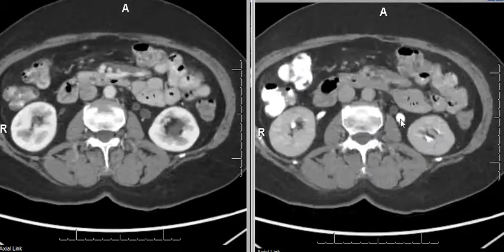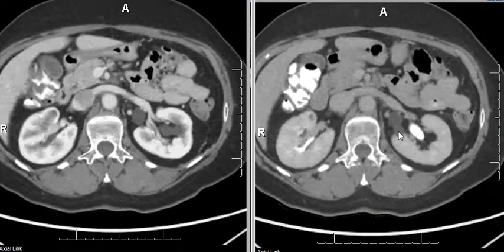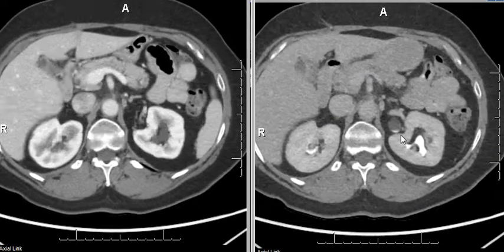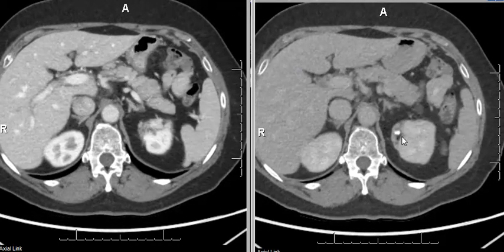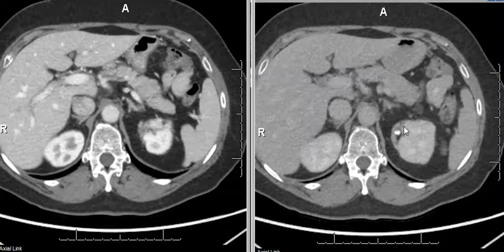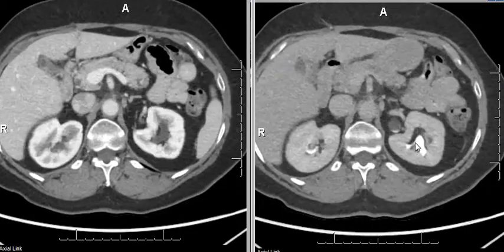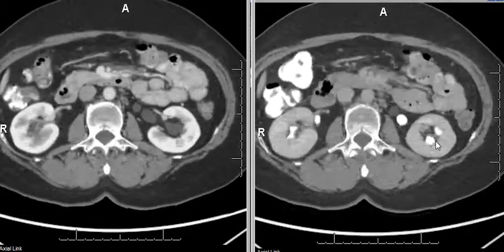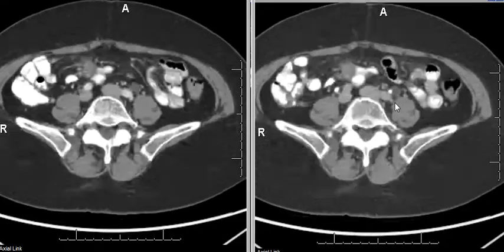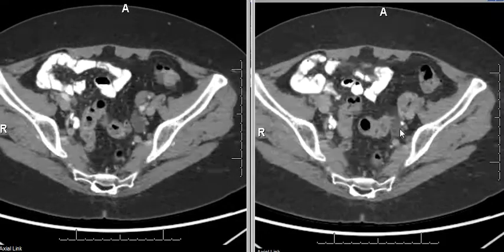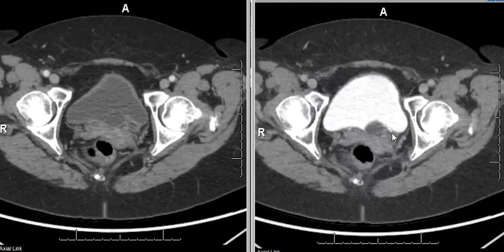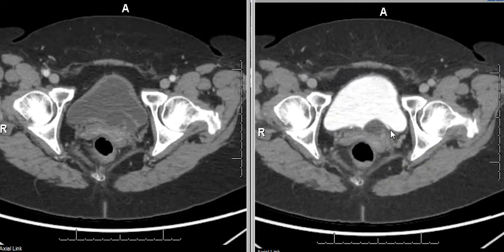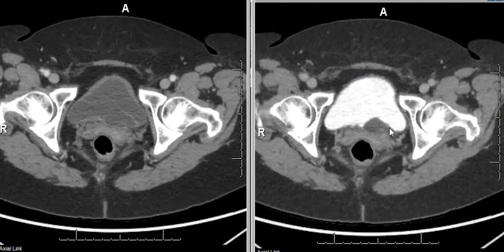The obstructed ureter draining into the ureterocele drains the upper pole moiety, which usually is dysplastic with poor function, as in this patient here, compared to the lower pole moiety which appears relatively normal and the ureter opens into the bladder at the bladder trigone.